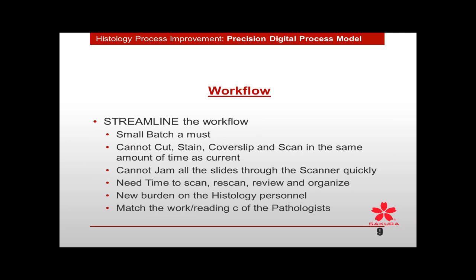Whether you have a scanner that does 4 slides or one that does 300 slides, I'm sure you load up a scanner and you press the button and the magic door closes. You have to understand that if I'm sticking in so many slides, when am I going to start getting data and how am I going to start working with that data? You need the time to scan, rescan, review, and organize. The more standardized, the more efficient, the less variation, and the more precise you get in your system, I'm pretty confident that you'll have fewer and fewer rescans, and you can then start streamlining that scanning and reviewing time.